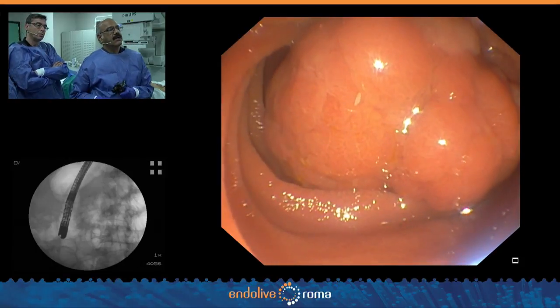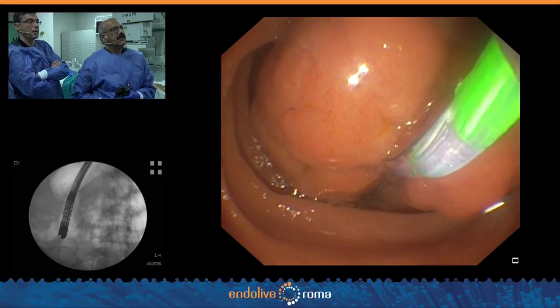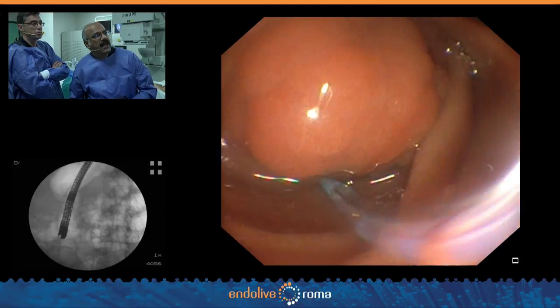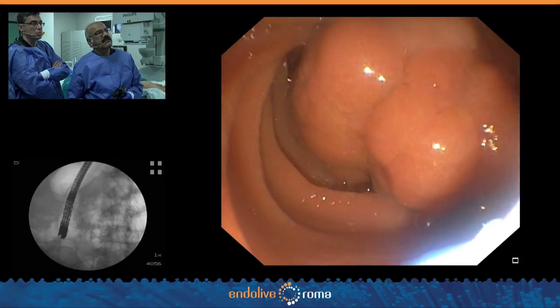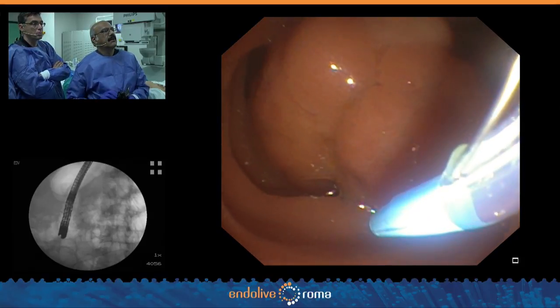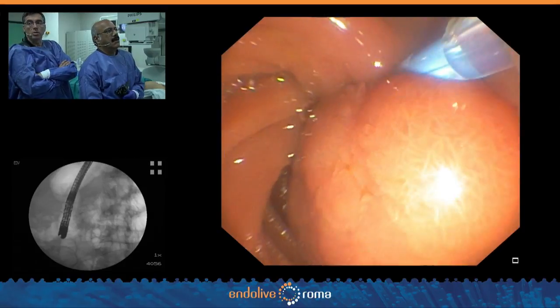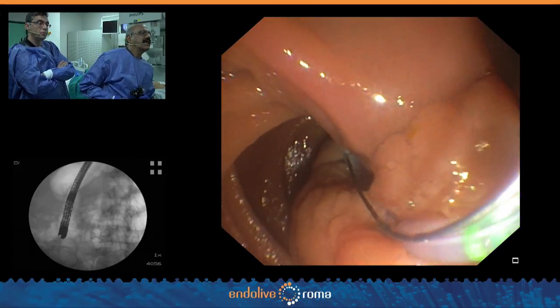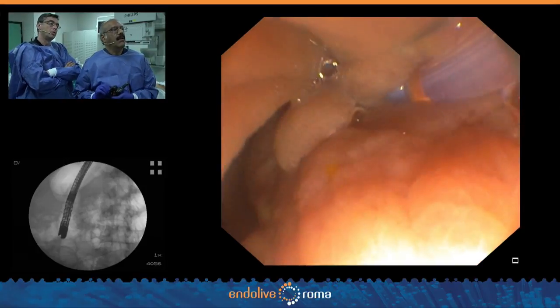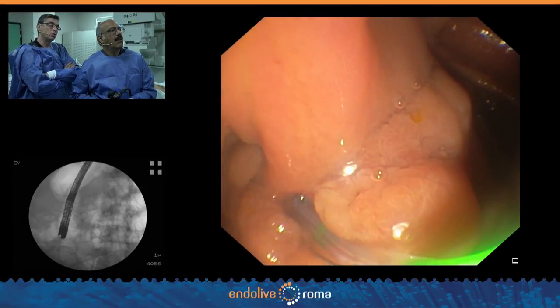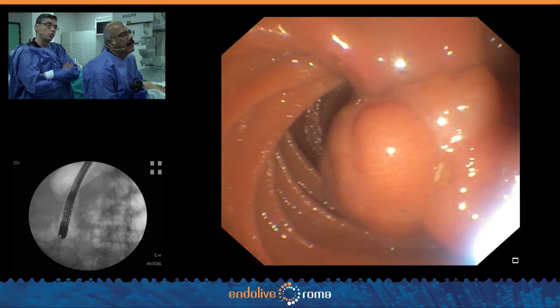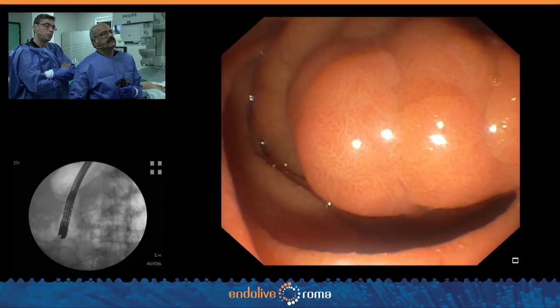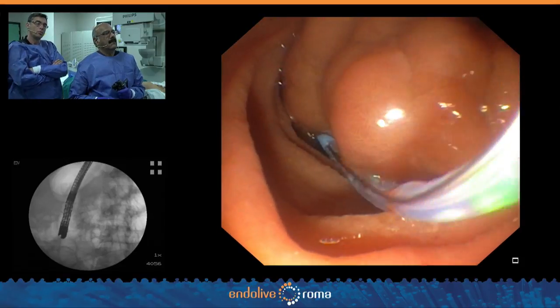We'll proceed with resection. There's no indication for submucosal injection here. On endoscopic ultrasound, there was no vessel in the stalk and no bile duct invasion. Could you explain to the audience the criteria for assessing the possibility of endoscopic en-bloc resection? The criteria would be: if the lesion is not laterally spreading and is pedunculated like this, then en-bloc resection is achievable.